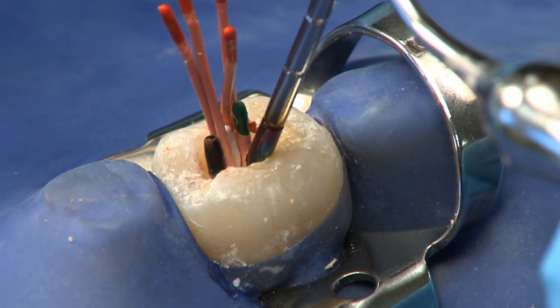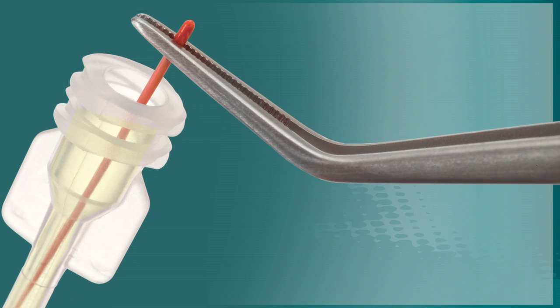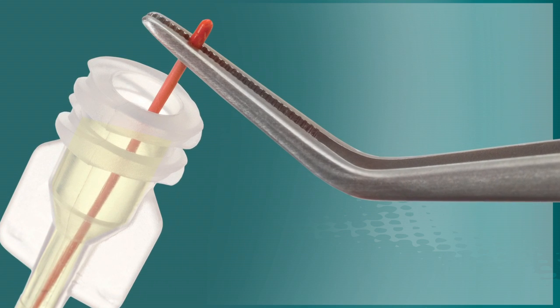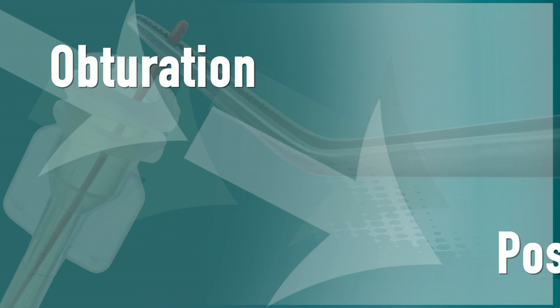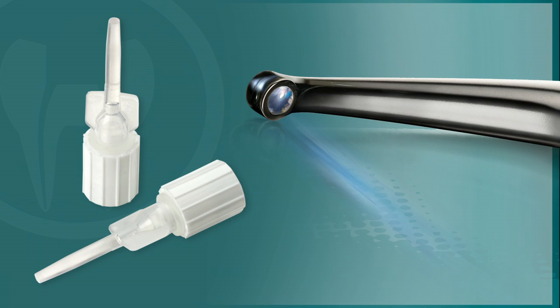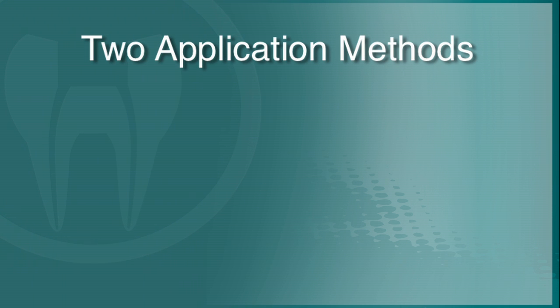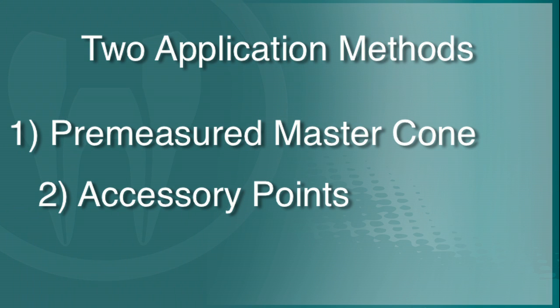Using a heated instrument or searing device, trim the excess gutta percha from the pulp chamber. For a faster set time, EndoRes Accelerator may be used to facilitate a 5-minute set. EndoRes Accelerator is an ideal way to move directly from obturation to a post-placement procedure without having to schedule a second appointment with your patient. When using EndoRes Accelerator, omit light curing the material and follow the subsequent steps. Please note that EndoRes Accelerator can be applied using either a pre-measured master cone or accessory points.